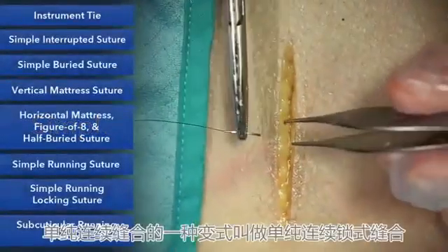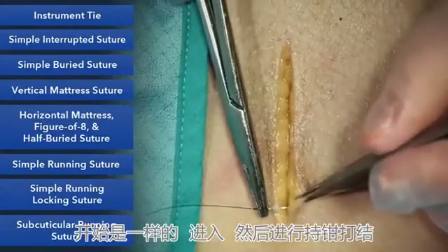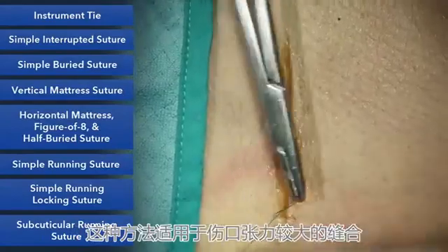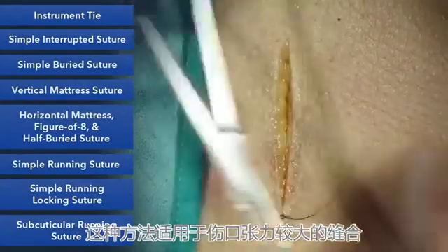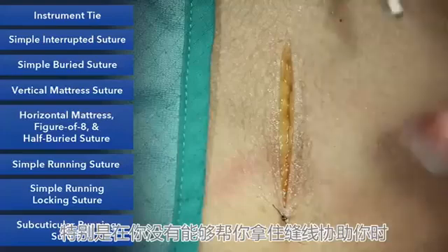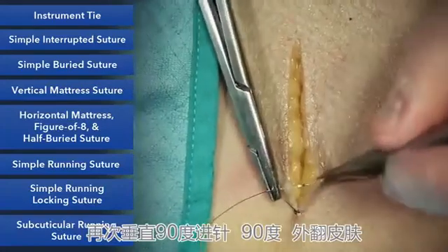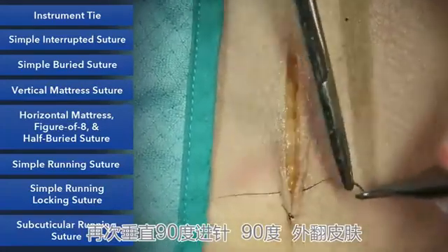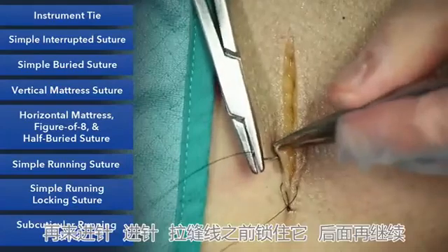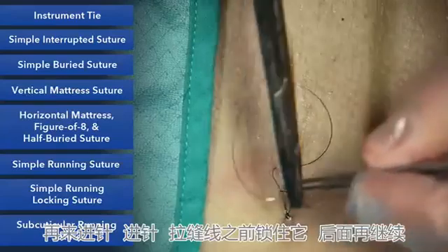A variation of the simple running suture is the simple running locking suture. We start off the same, with simple bites and a nice instrument tie. And this is a very helpful suture when you're sewing under some tension, and especially when you don't have an assistant who can help hold the suture for you and follow you. You'll take your simple bites, again, 90 degrees, evert the skin edges, but before you pull up, you'll make sure and actually lock the suture. And take your simple bite, and again, before pulling up the last little bit, you'll lock your suture.